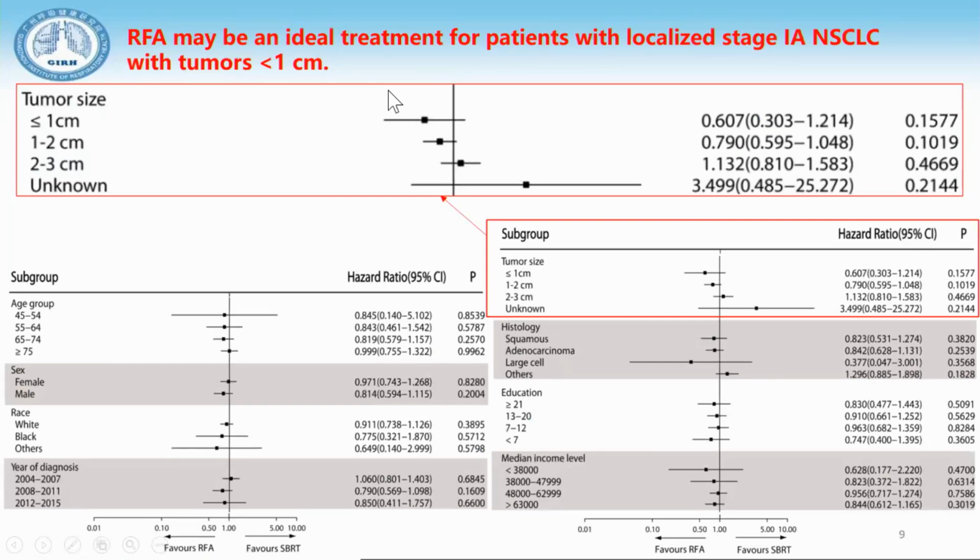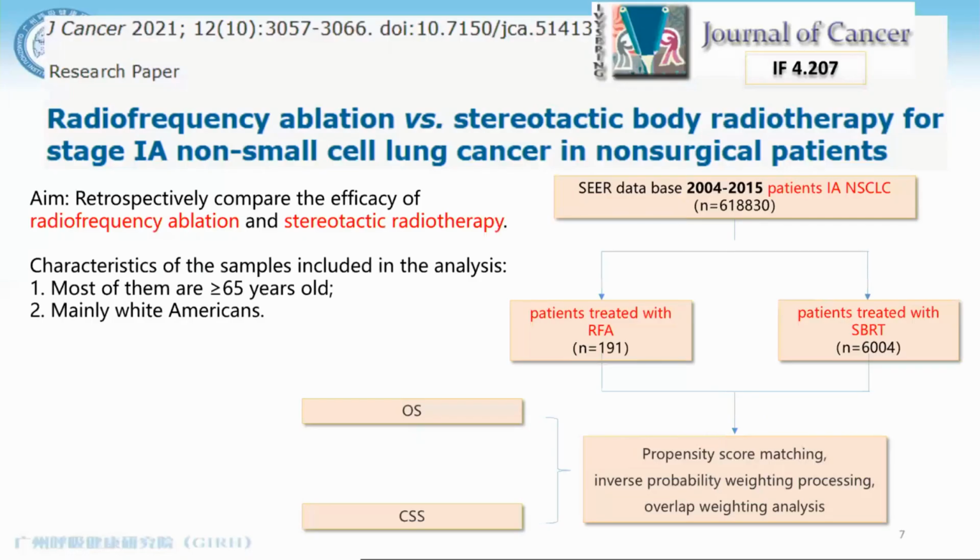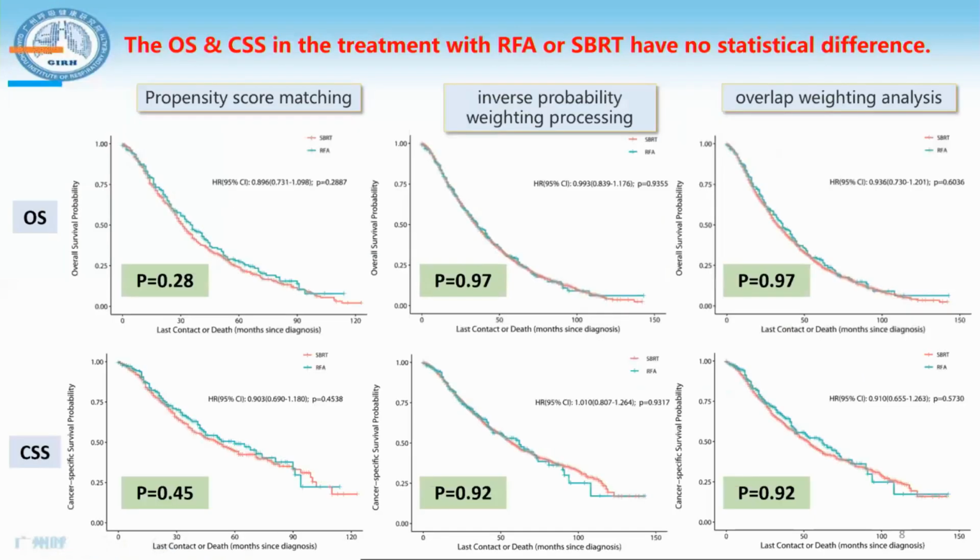This data shows that for small lesions, radiofrequency ablation gives quite a good result. And as we know, with this method, the radiofrequency ablation is performed percutaneously under the guidance of CT.